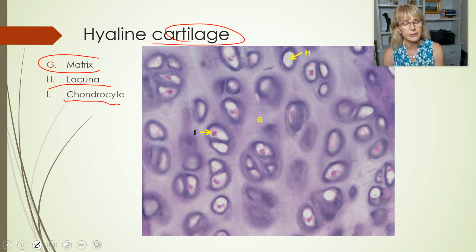In previous semesters on the lab midterm, there's been this picture that asks you what kind of tissue this is. Well, that's pretty easy because you only have to learn 2 tissues in AP 120. You only have to learn what bone tissue looks like and what cartilage looks like. So you should be able to do that. Bone tissue is going to look like osteons, very organized, with noticeable rings. Cartilage has either a blue or a purple matrix, and it has lacunae, but it doesn't have that structure of the lamellae.